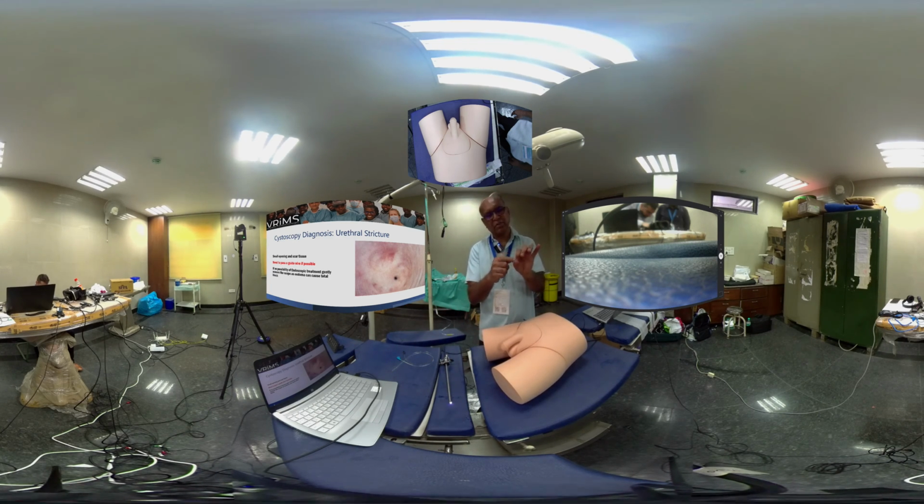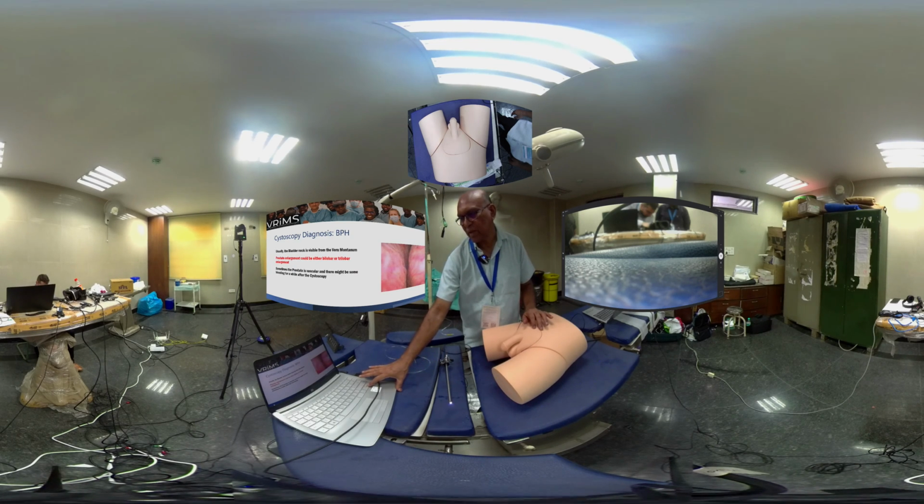The normal urethra is about 30 French or 1 centimeter in diameter, and this will not even allow a small infant feeding tube to go through. So this is why it is dangerous to do blind urethral dilatation. You need to pass a guide wire, and once it reaches the bladder, cut the strictures under vision.